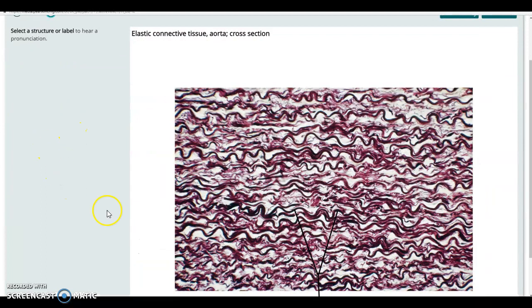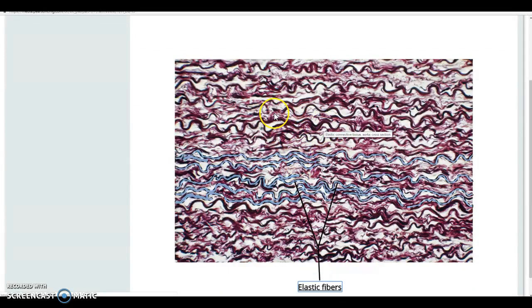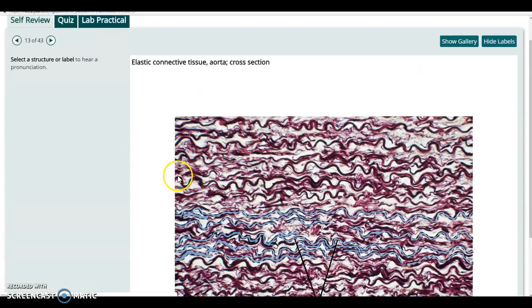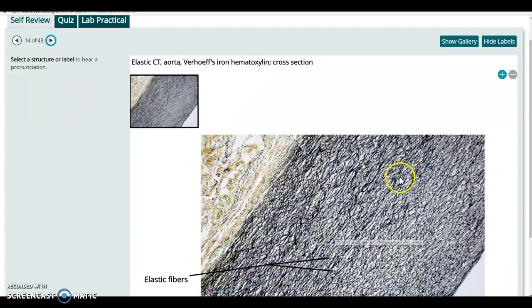This is an elastic connective tissue. The elastic fibers are very curlicue or in a wave like that. They stain much darker. They don't tend to show up in the same stain as the collagen fibers, so a really nice view of this from the aorta. And that's just another view of more of that elastic fiber with the curlicue or the kind of wound up fibers like that.